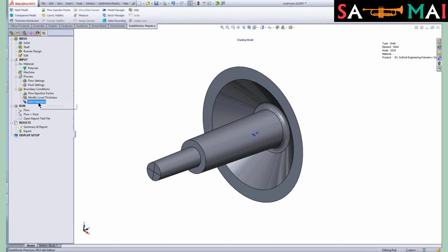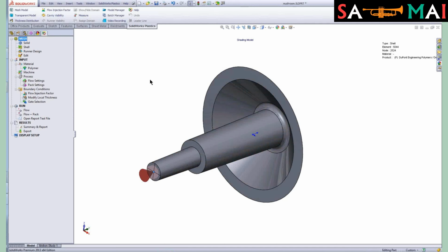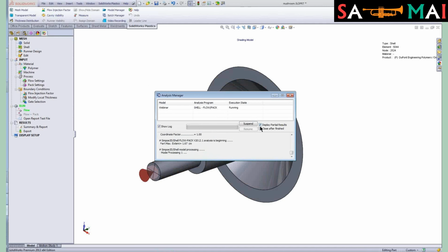Last but not least will be our gate selection. All we have to do is tell Plastics where the gate is going to be located. So I can just click at that node, which is going to be at the center of that face, put in a recommended size, 1.25, and then add the gate. And that's all there is to the setup. So let's go ahead and run our flow analysis.